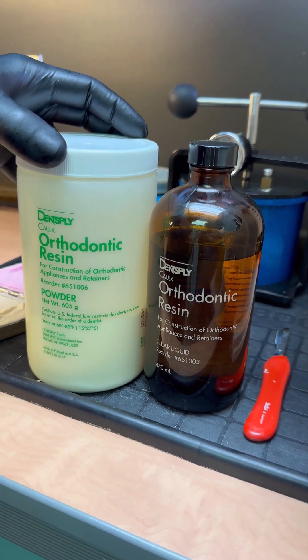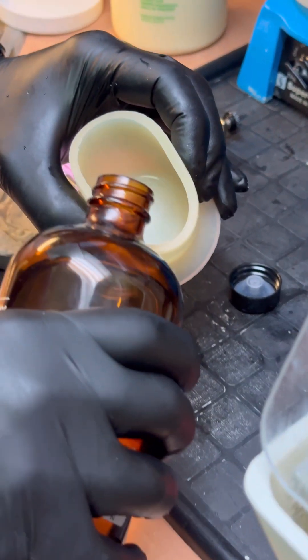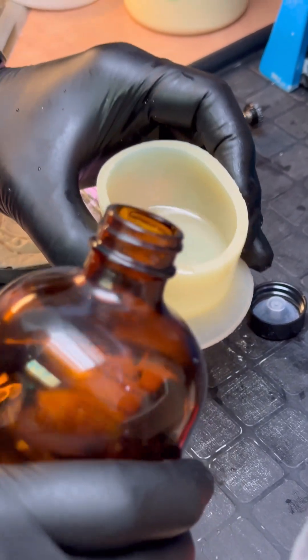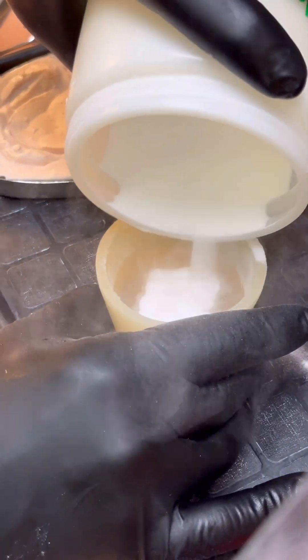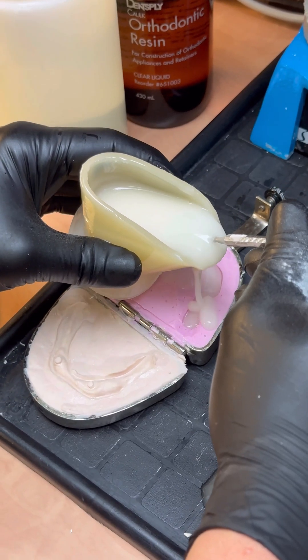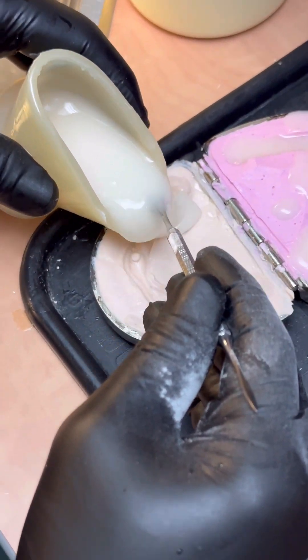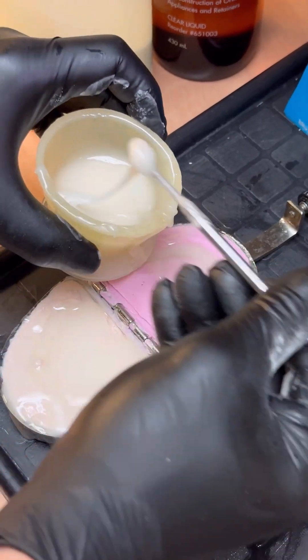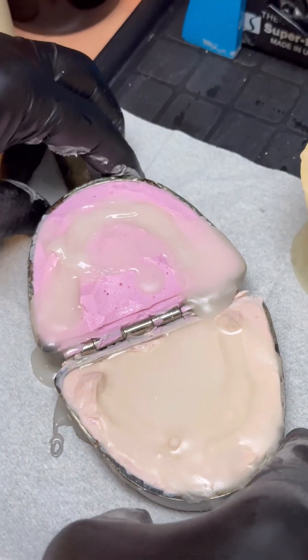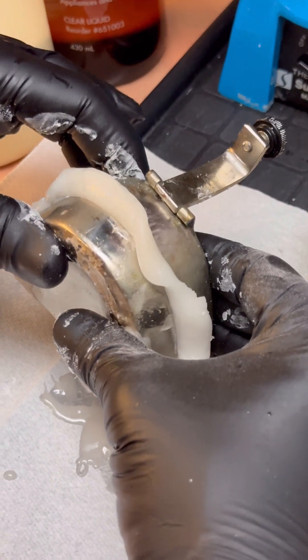Let's start by making a surgical guide. We're going to use clear orthodontic resin in order to duplicate the denture so we can make a surgical guide. We'll start by pouring some liquid resin into the bowl, and now we're going to pour it into the mold. Once you've poured one member, you will pour the other side. Now that we've filled both members, we can close the flask, and you're going to have to push all the acrylic out.